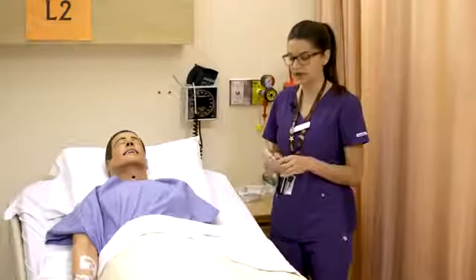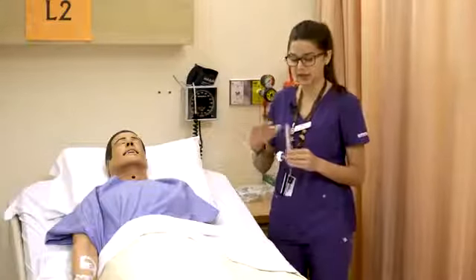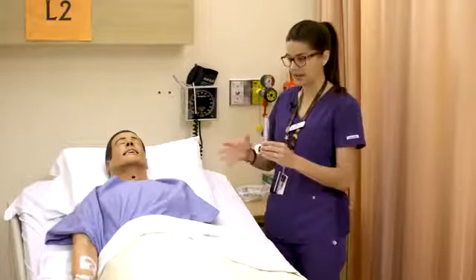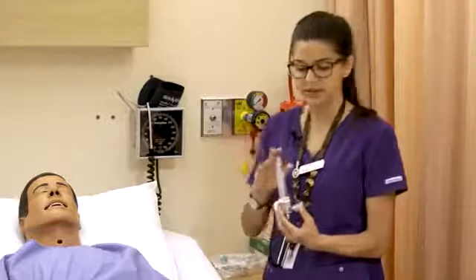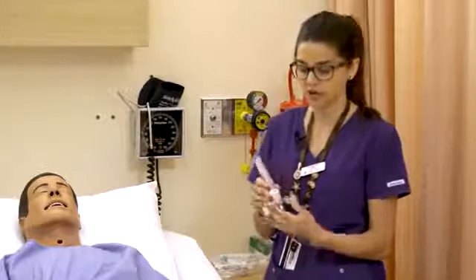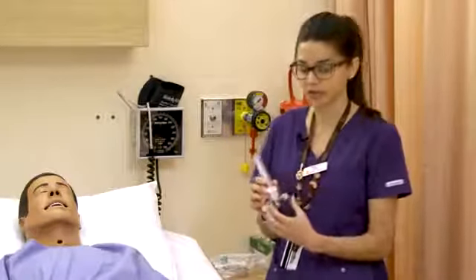Before we do that, oxygen isn't necessarily administered using that FiO2. It's actually delivered using liters per minute. That's how we signify the amount that we're giving consistently. So you'd use a device called a flow meter to deliver a specific liter per minute amount of oxygen.